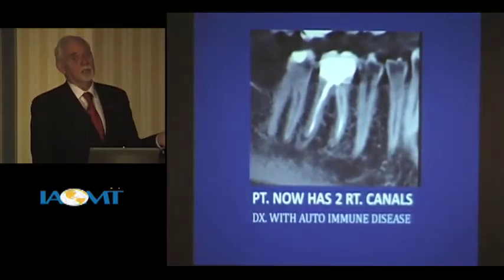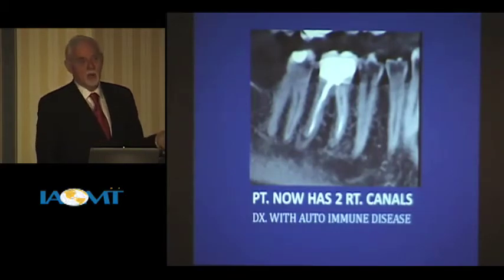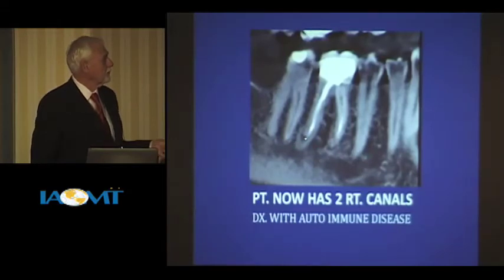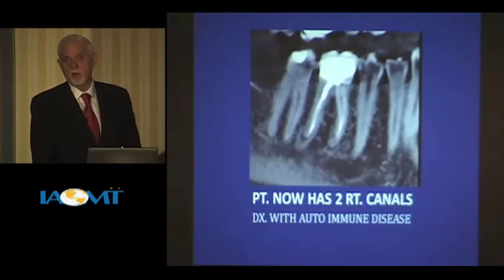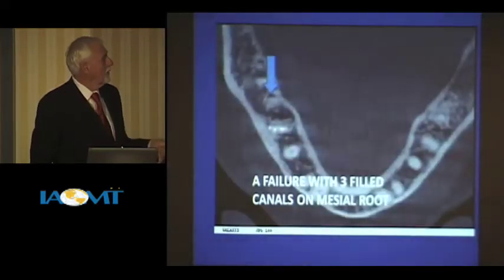Okay, this is a very close friend of mine. I'm not her dentist. She sees somebody else. She actually came by the office one day and I said, "Oh, let me do a CAT scan for you," and she let me do that. She is very traditionally minded, dentally and medically. She now has another root canal treated tooth. She has now been diagnosed with autoimmune disease, and she's 45 years old. I don't know that she's going to do anything about it. Doesn't hurt, she said.